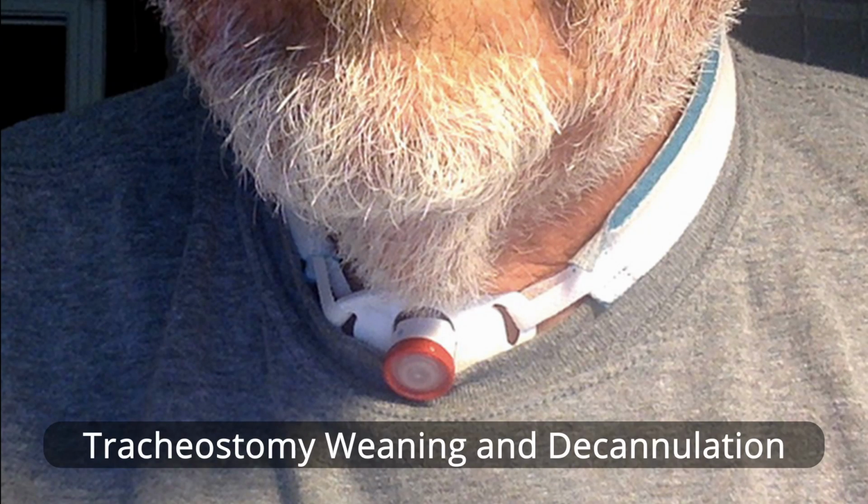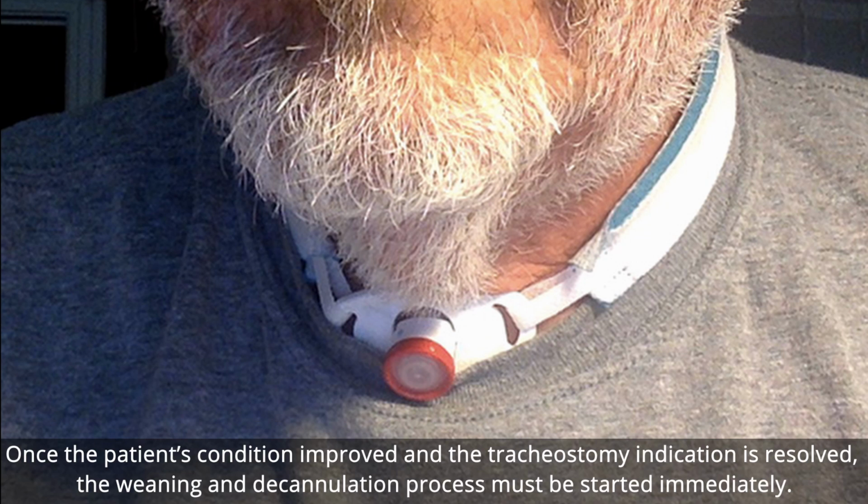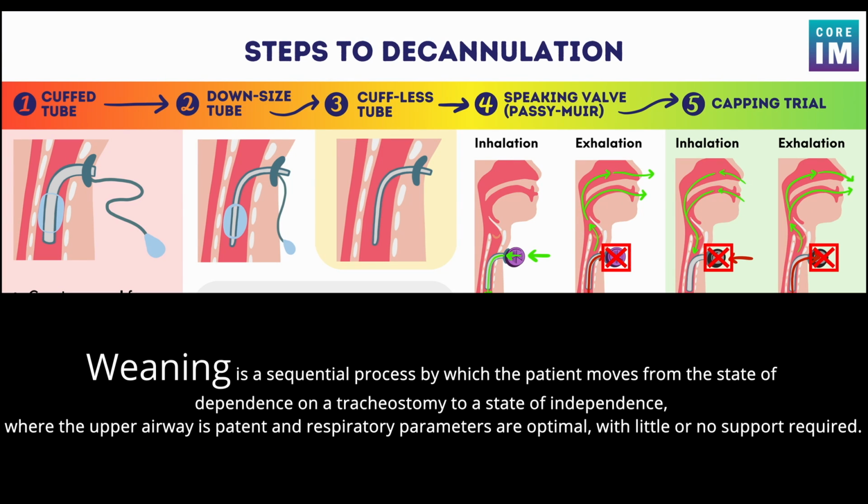Now we are dealing with tracheostomy like any invasive line, like Foley's catheter, like central line, like cannula. We are looking to remove it out. Tracheostomy weaning and decannulation. Once the patient condition improves and tracheostomy indication is resolved, the weaning and decannulation process must be started immediately. Weaning means gradually.